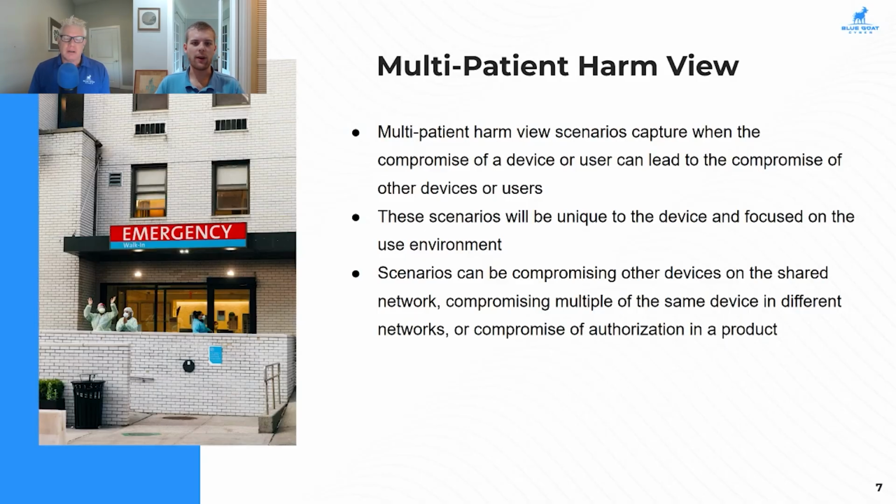And of course, it's going to be very device specific. Some devices may not connect into the network, so they're not going to be a great candidate for ransomware. Some devices may be entirely cloud hosted, and so they aren't going to interact with internal networks. There's a range of how multi-patient harm views can apply, which is why it's going to be so unique based on the device.